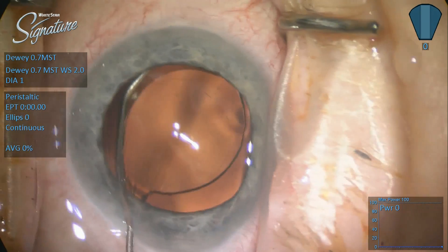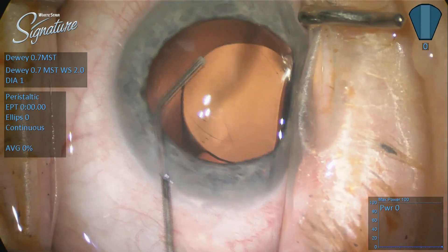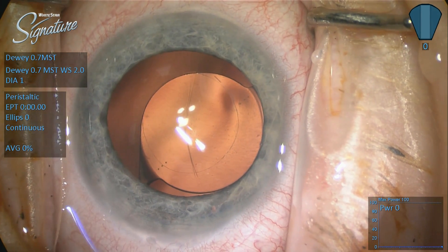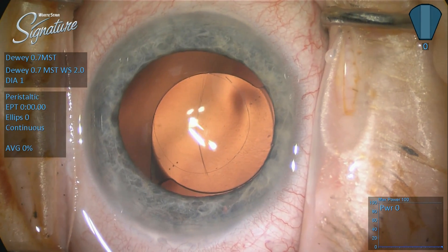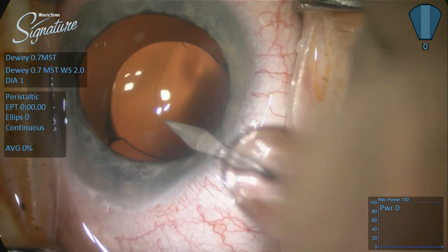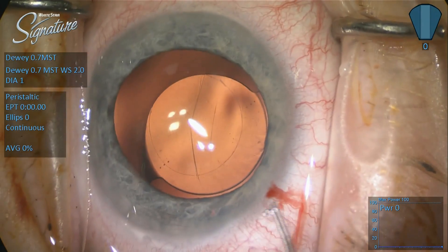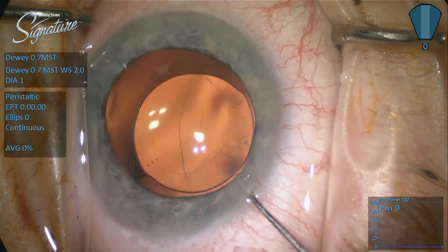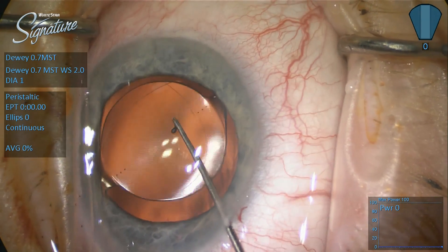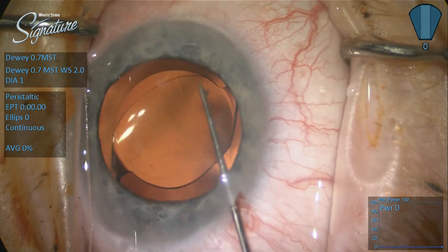This is the second time we're doing this, so I've got a different plan: reverse optic capture. We're going to displace the nasal capsule off the edge of the optic, slide the optic a little bit temporally, and then go in and create a brand new side port incision. The original plan had been to use a CTR, but I got to thinking about the technical challenges involved in placing a CTR in an eye where the capsule has contracted considerably. Now I'm going to take a Lester hook and basically depress the temporal optic, push it nasally, and get the optic to override the nasal aspect of the capsule.